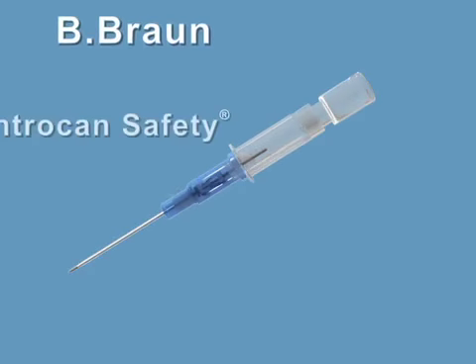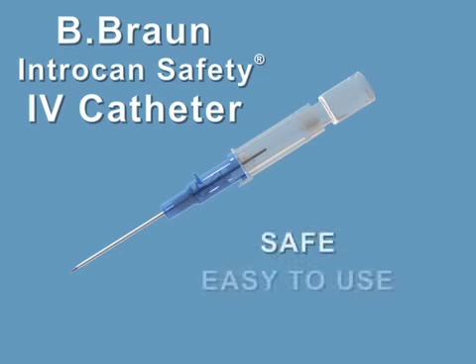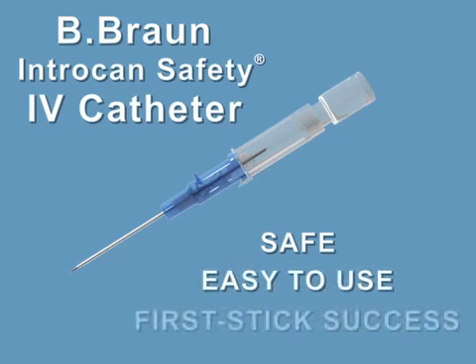The B. Braun Introcan Safety IV Catheter with Passive Safety Technology. Safe and easy to use, resulting in first stick success.